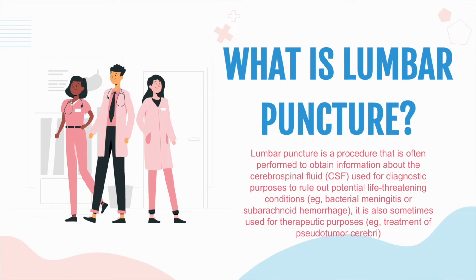So first is, what is lumbar puncture? Lumbar puncture is a procedure that is often performed to obtain information about the cerebrospinal fluids used for diagnostic purposes to rule out potential life-threatening conditions like bacterial meningitis or subarachnoid hemorrhage. It is also sometimes used for therapeutic purposes like the treatment of pseudotumor cerebri.